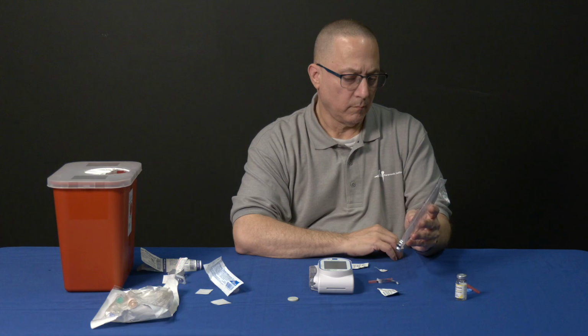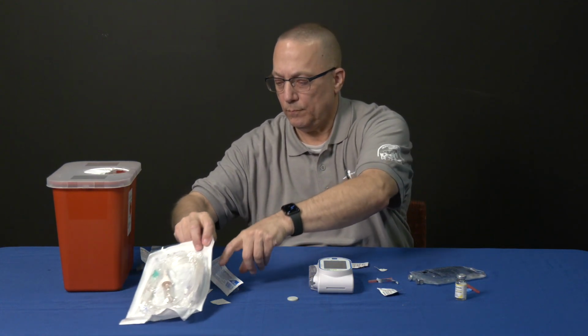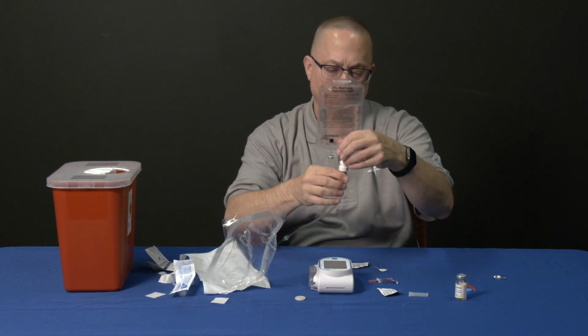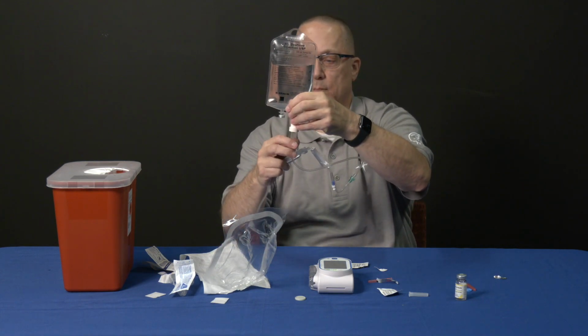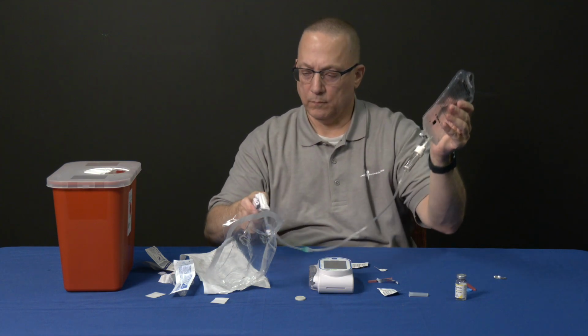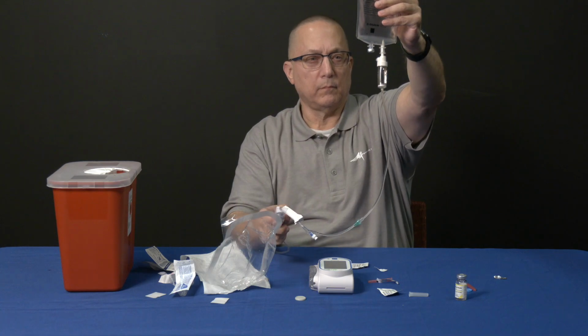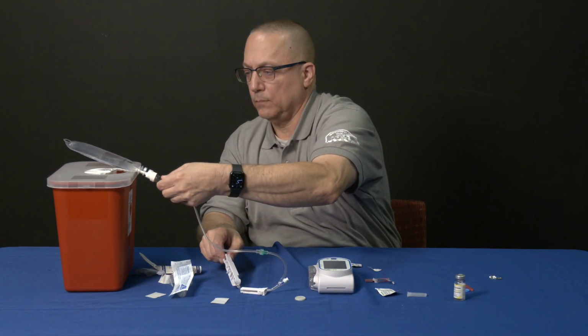Next, spike the bag of medication with the Sapphire pump drip set. On the back of the cassette, we can depress the flow stop tab that will allow the medication to flow through the drip set. Once all air is expelled, we can release the tab and stop flow. Open the cassette chamber door.